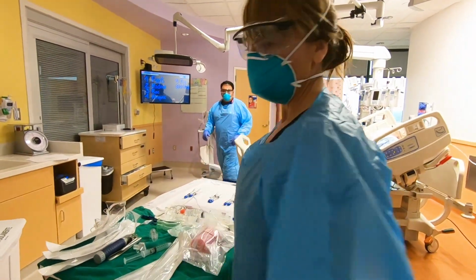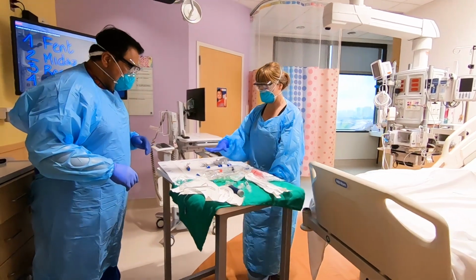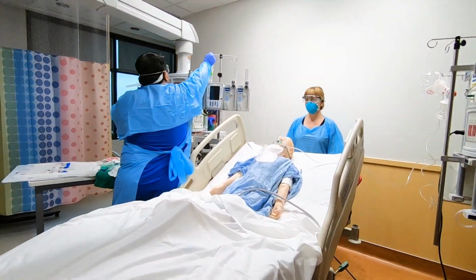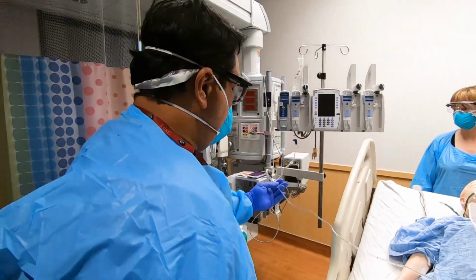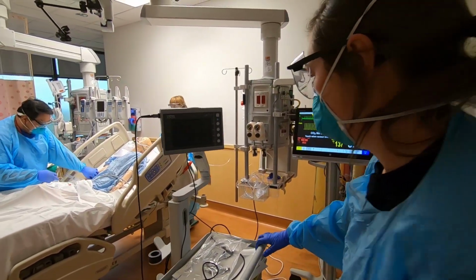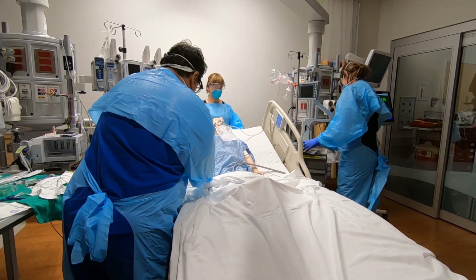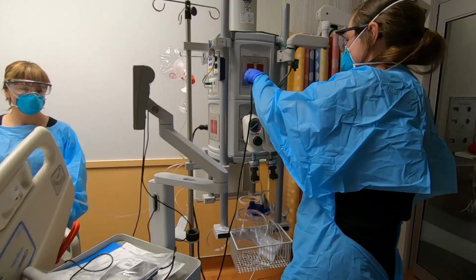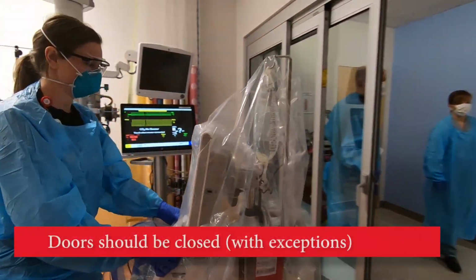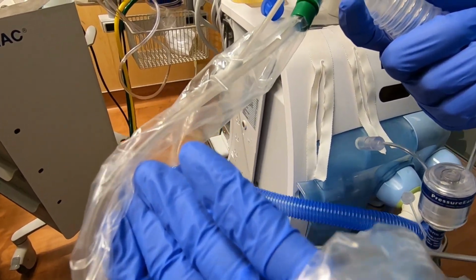The airway supplies and medications are placed on a table on a clean chuck and brought into the room by members of the intubation team. The CMAC is preferred for intubation if possible. Inline suction should be set up and attached to the ventilator.